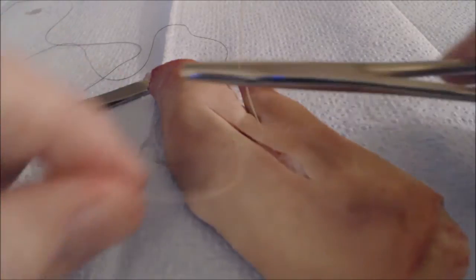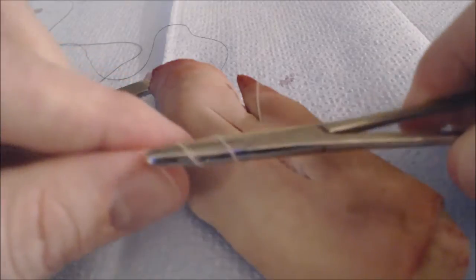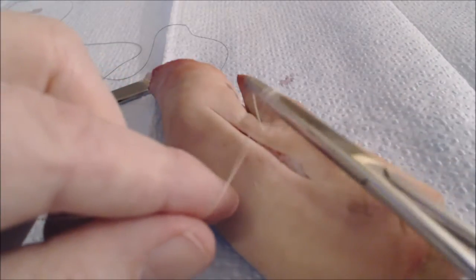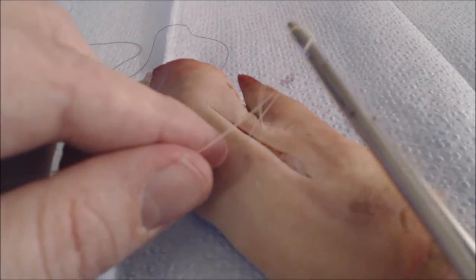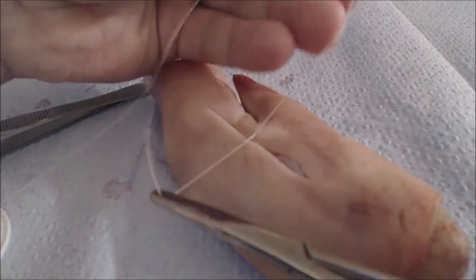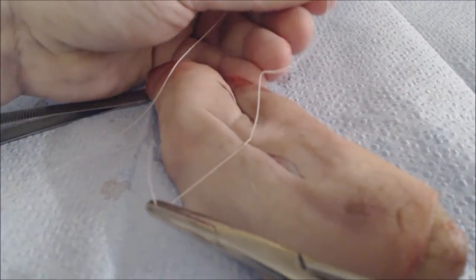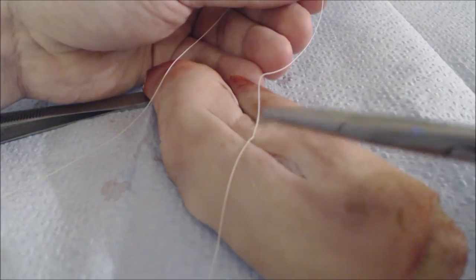The instrument tie: you take your needle drivers and the thread and you wrap the thread around twice over the jaws of the needle holder, and then grasp the free end of the suture and bring it through. Because we wrap the suture around twice, we've made the equivalent of a surgeon's knot.